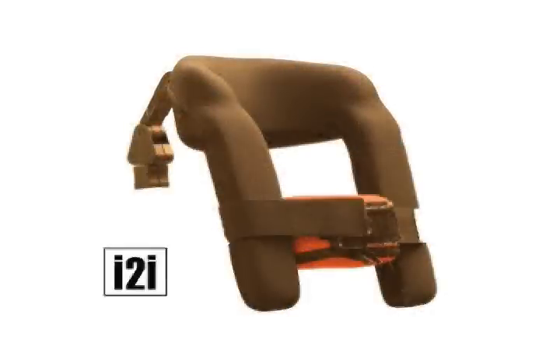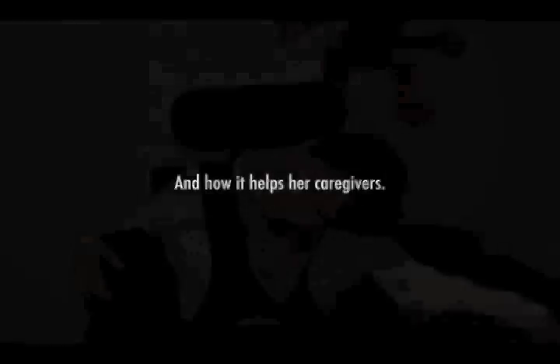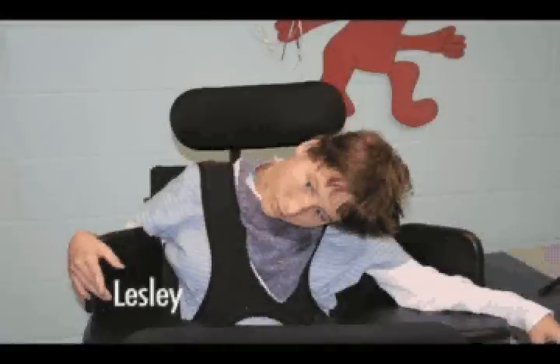Thanks for taking the time to learn more about the eye-to-eye, Stealth's new Head and Neck Positioning and Support System. What we're going to be doing is just giving a little video of one of our students using the eye-to-eye to assist them with their eating, and then we're going to have a short video showing how their eating and swallowing is without the eye-to-eye on a more traditional headrest.